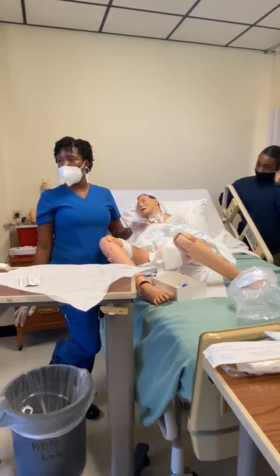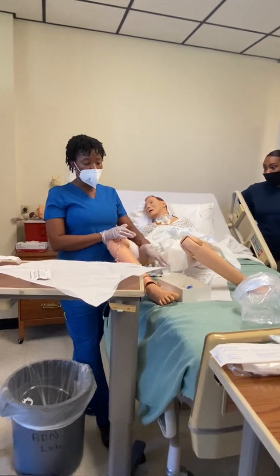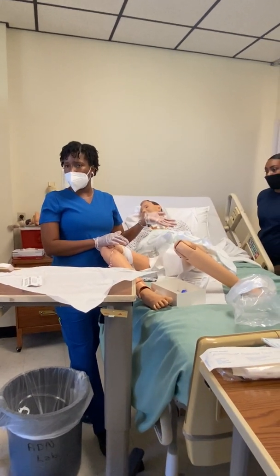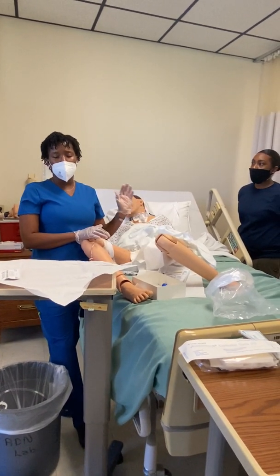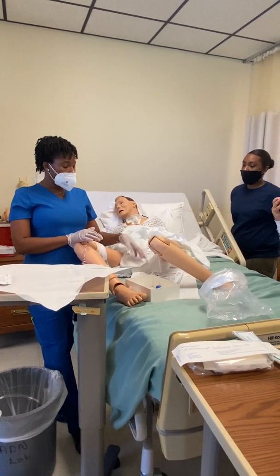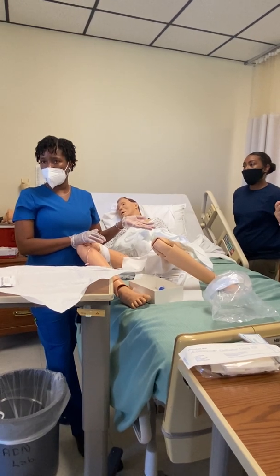But if you had to do it for a patient and you didn't have it, make sure you have a waterproof moisture pad, okay? Go in and explain everything to your patient that you're going to do. I'm going to take your catheter out, we're going to retrain your bladder, and you may feel a little bit of discomfort, but I'll tell you when, and I just need you to take a deep breath for me, okay?